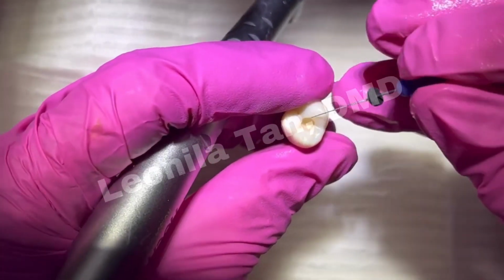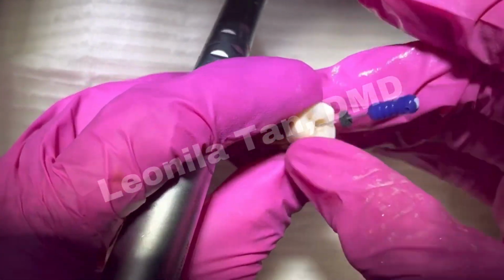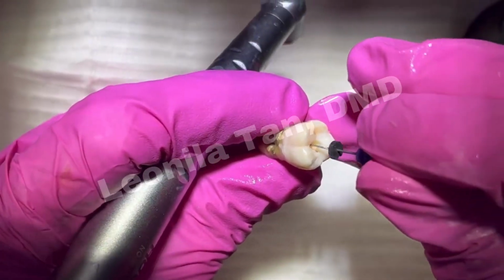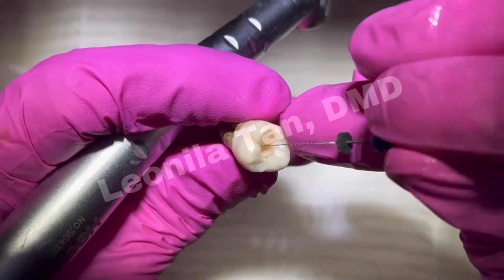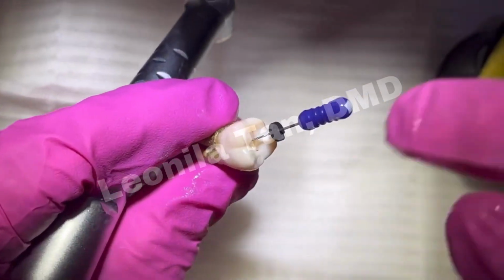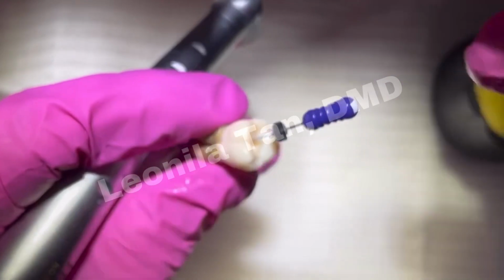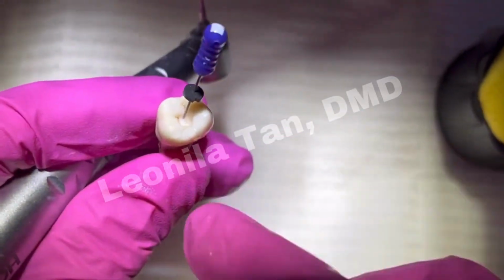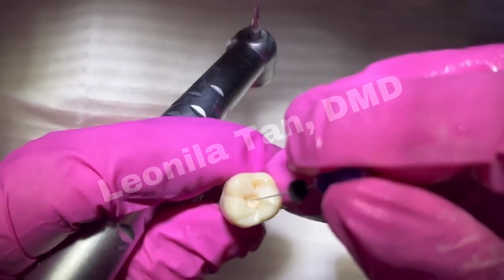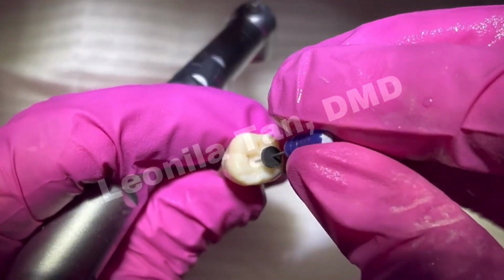So let's see, we found the distobuccal. Notice the direction of the file, and let's see if we have another opening. Okay, now this one goes towards the mesial direction. Mesial direction, but it's tight, it goes in.